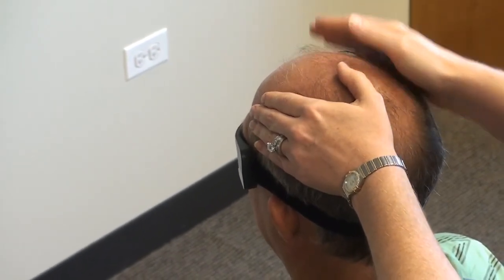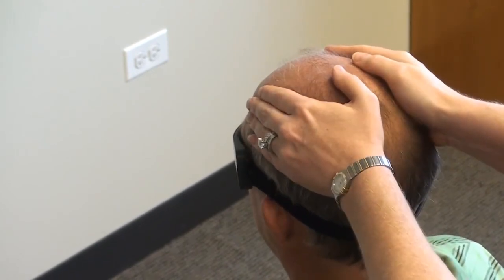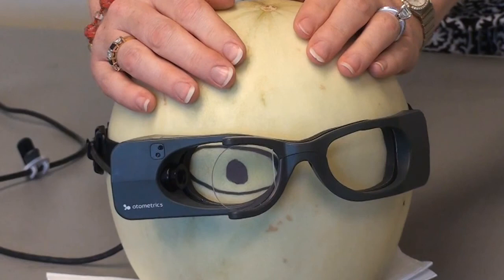But also notice that as we move from here to here, it is a fast movement, 150 to 200 degrees per second. If you have never done head impulses before, you're going to need to practice. It is best not to practice on the patient. This looks a little odd, but you can be creative. You can get a melon from the grocery store or use a ball.